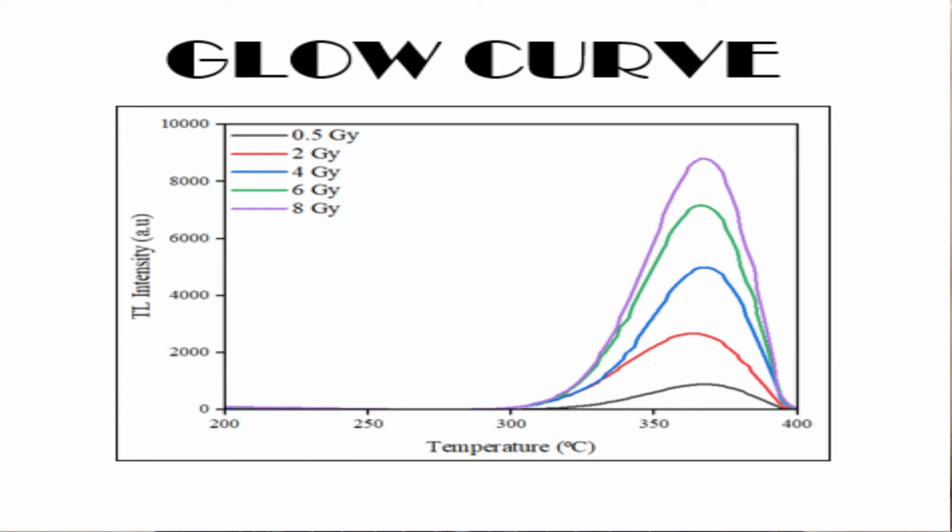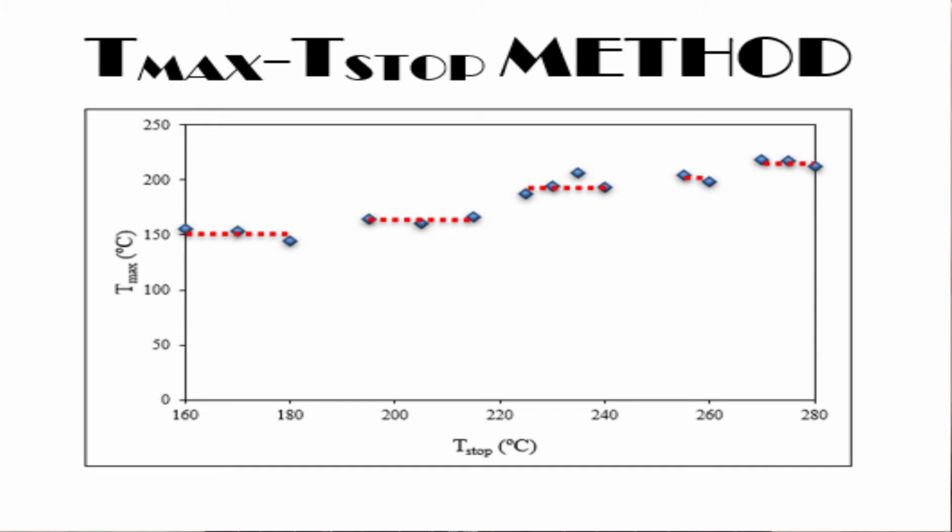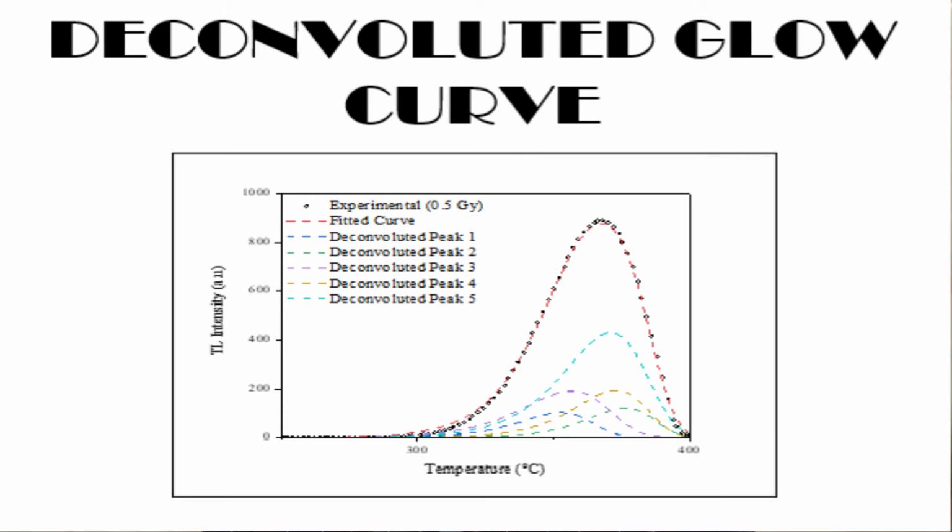An important physical factor in determining the stability of a given thermoluminescent material for medical application is the temperature at which the peak of the glow curve occurs. The figure shows the stacked glow curve with background subtracted for the irradiated glass sample. In an extensive experimental procedure, the deconvolution of the thermoluminescent glow curve was carried out using an alternative method called T-max T-stop, which can be effective in identifying sub-peak positions. According to the figures, there is evidence of 5 staircase-like plots corresponding to the existence of subpeaks positioned under the encompassing glow curve. Following the mentioned method, the glow curve was then deconvoluted using GlowFit software, with 5 subpeaks being apparent underlying the broad peak of the glow curve.